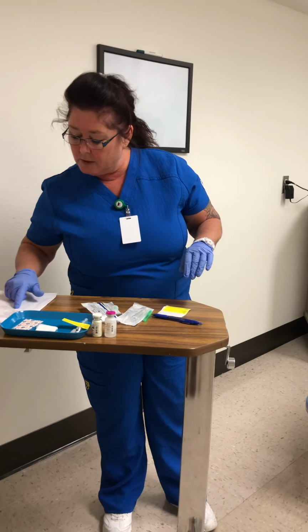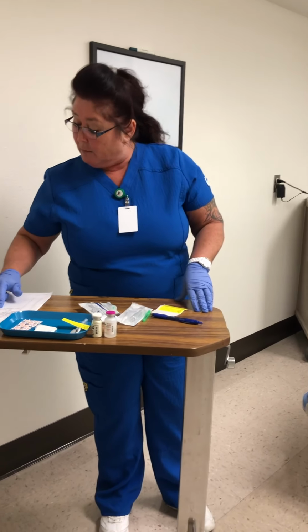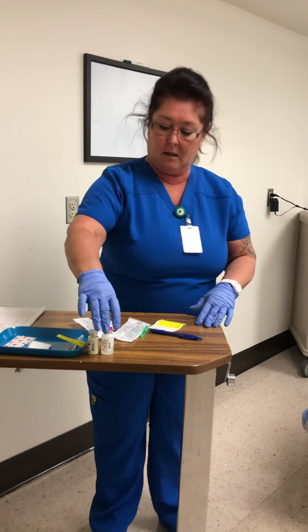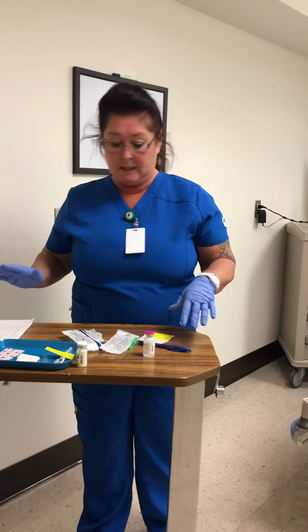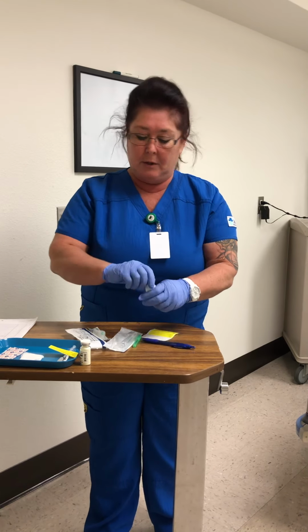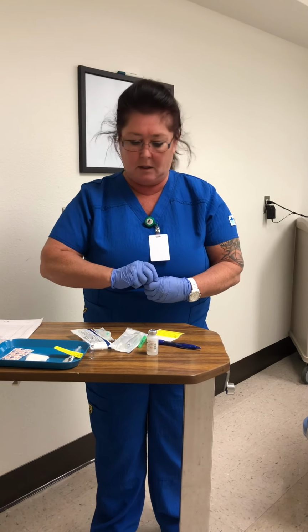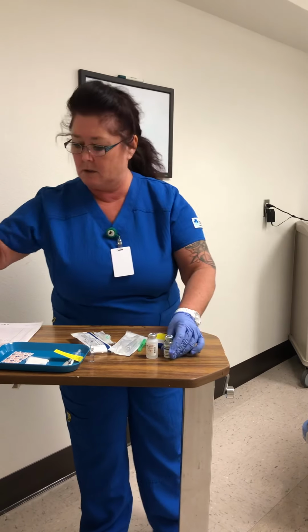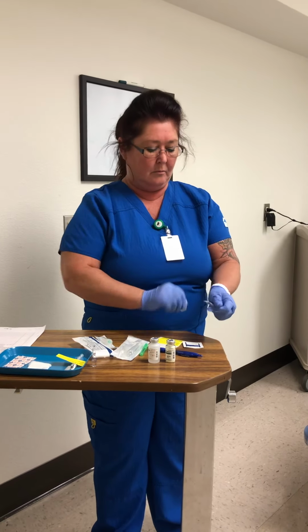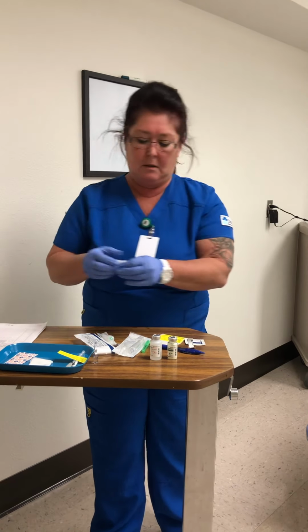Next, we are doing the ceftriaxone, 250 milligrams intramuscular OD, this is the anti-infective. And this one I have done my dimensional analysis on. So I know that I am going to be pulling 1 mil. But again, I am going to take the tops off of these. I'm going to get my sterile wipes. And I'm going to disinfect the tops.